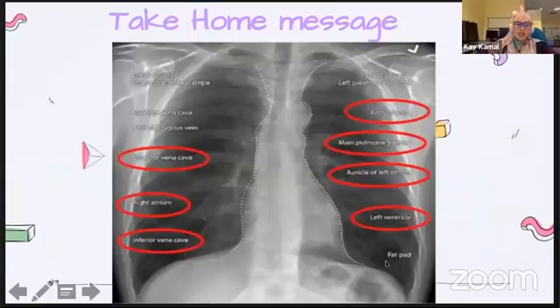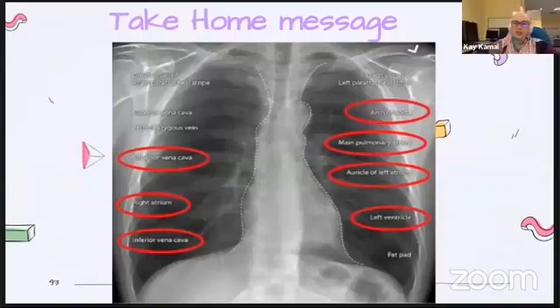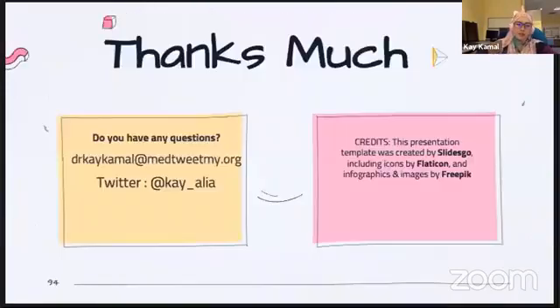If you see any of them not looking normal, you don't need to make a diagnosis out of it. You can always talk to us and we can help you out, and most of the time we cannot pinpoint it for you, so we will still offer you a CT scan anyway. So yes, you need to understand the normal to be able to see what is abnormal.